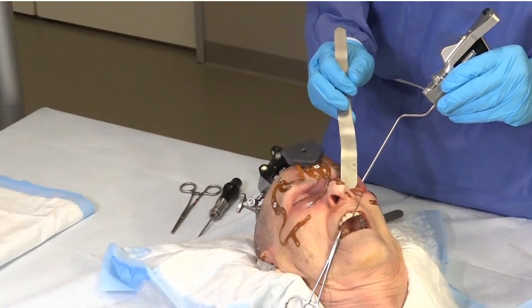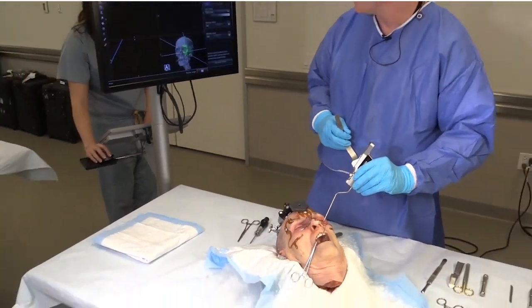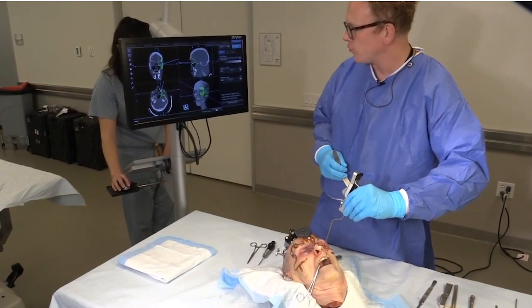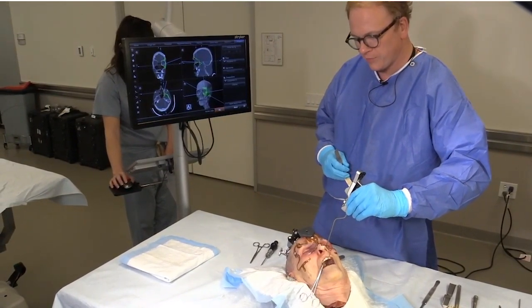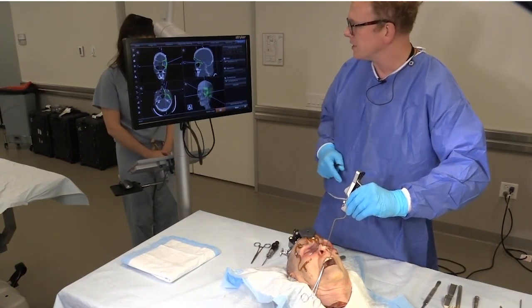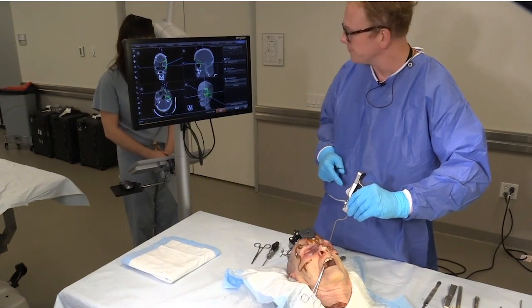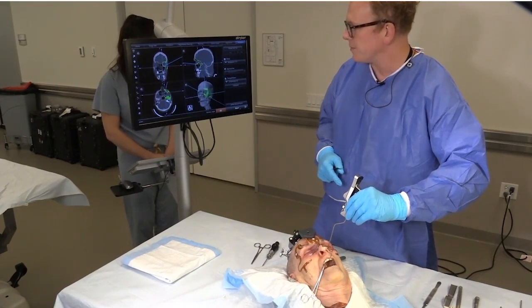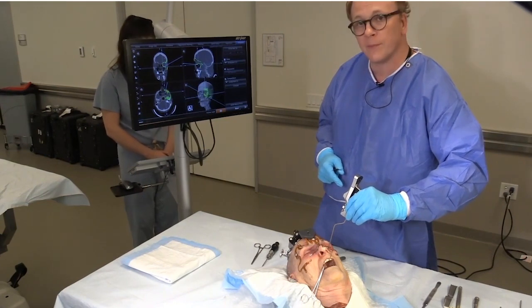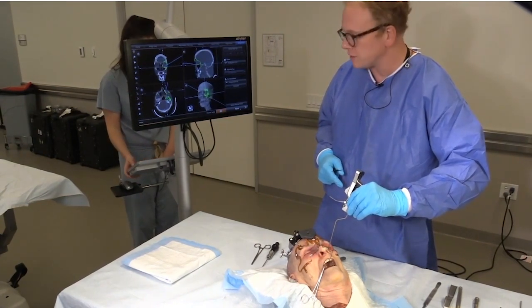Now I want to verify it. Using my navigation data set, I'm going to place the probe on the implant and move it along the implant, front to back. Looking at the sagittal projection, I can see the probe moving along my perfected anatomy. If the probe ends up in the sinus, that suggests the implant has slipped off — it's in the wrong space. That allows me to adjust.